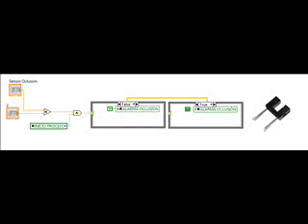For the alarms, we use two optical barrier sensors. These are capable of detecting objects and, in our case, the variation between air and solution. This is very useful in the detection of air bubbles and when there is an occlusion before the microdrip chamber, which could tell us that the solution is over or that there is an artifact that doesn't let the water flow through the chamber. In this last case, the program has a condition: the alarm is only activated when this happens and the process is in progress.